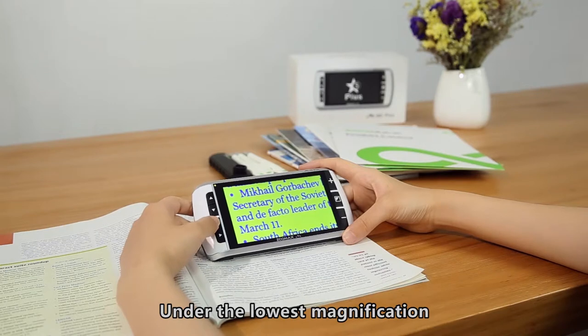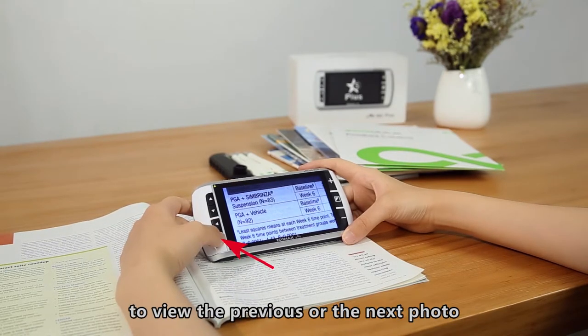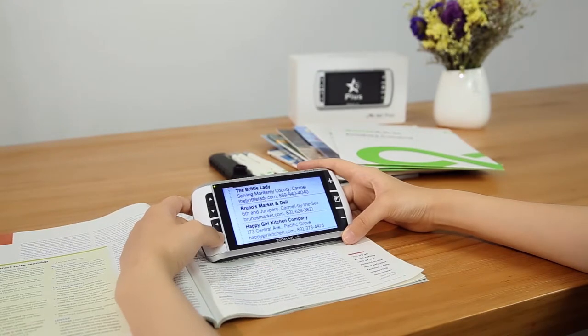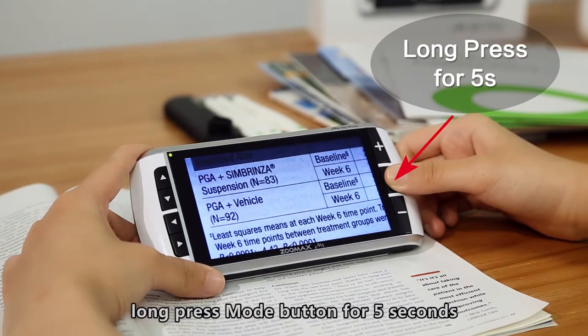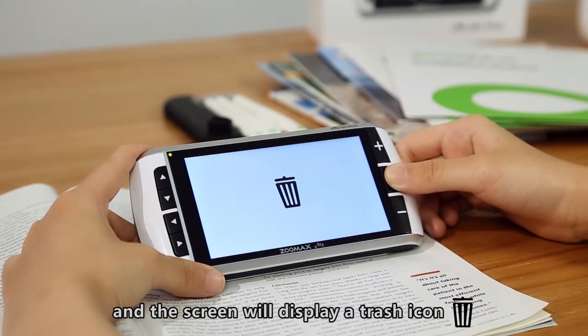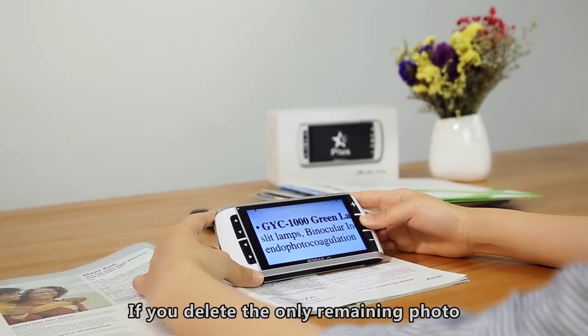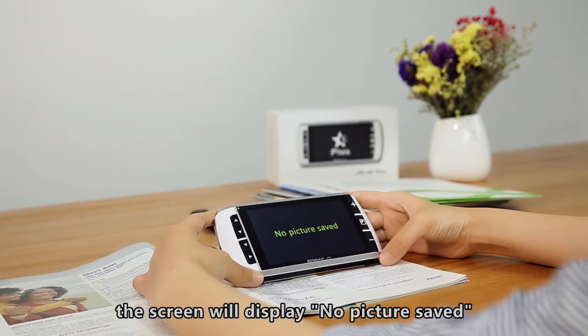Under the lowest magnification, press the left or right button to view the previous or the next photo. When viewing a saved photo, long-press the Mode button for 5 seconds. The chosen photo will be deleted automatically and the screen will display a trash icon. If you delete the only remaining photo, the screen will display 'no pictures saved'.